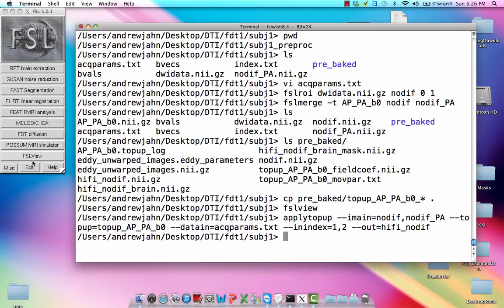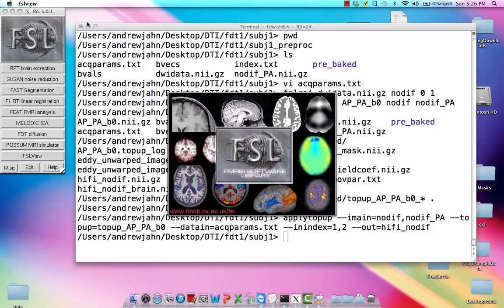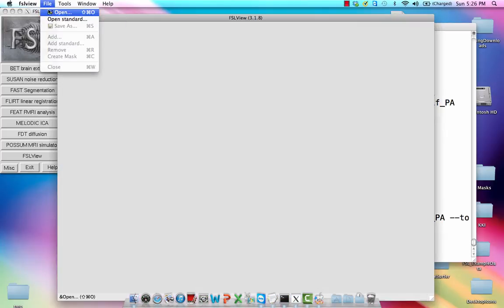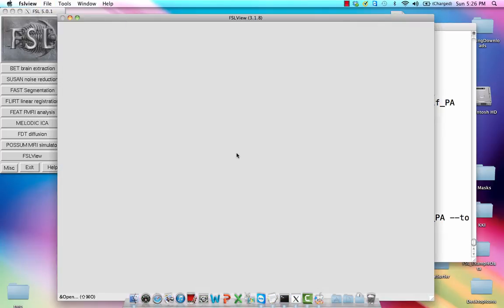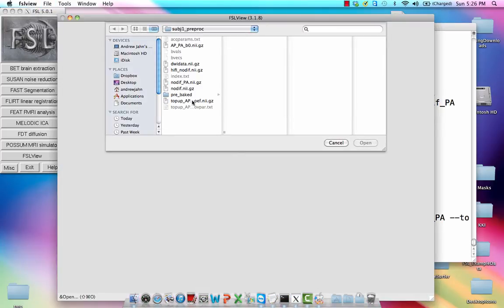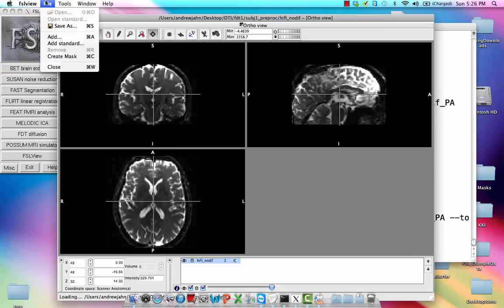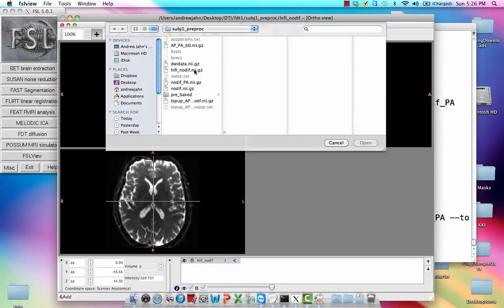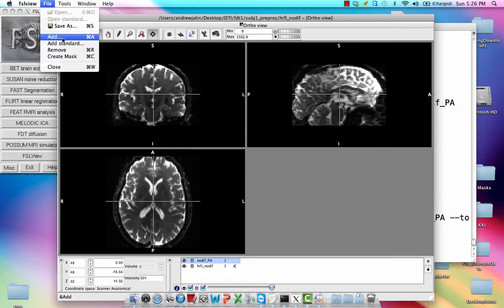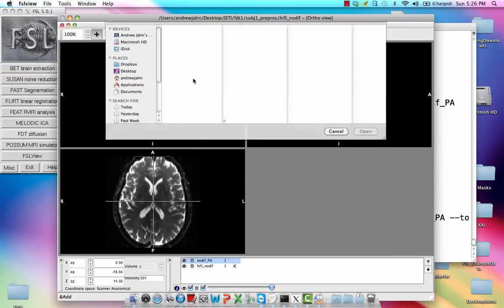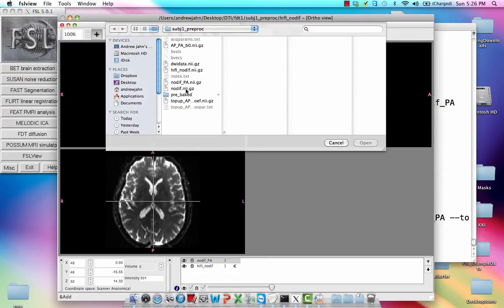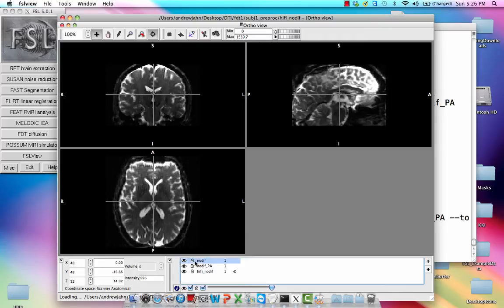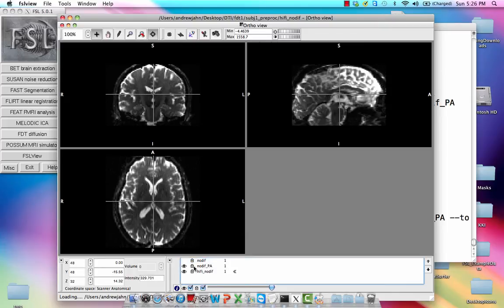And once that is done, we can open up FSL view again. Open up this hi-fi dataset that we just created. And also compare that to both of those files which had not had any distortion correction yet.